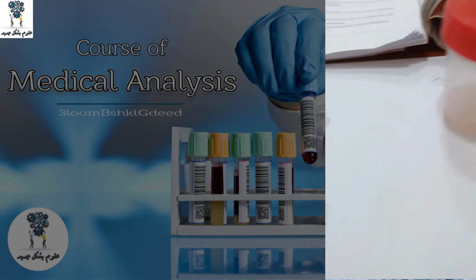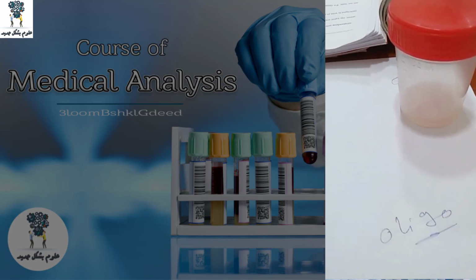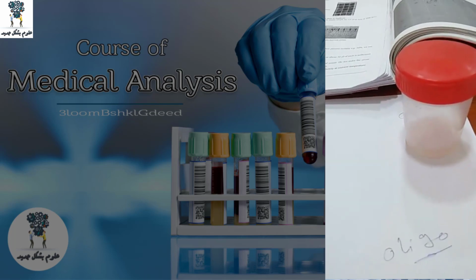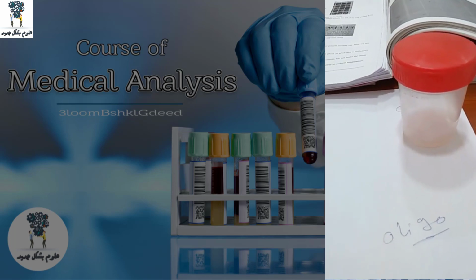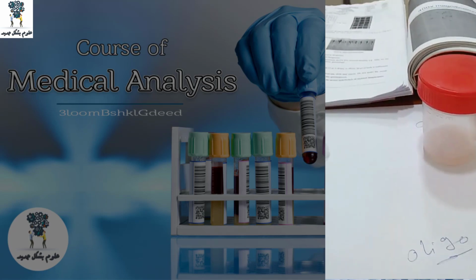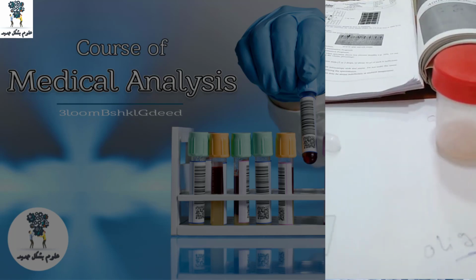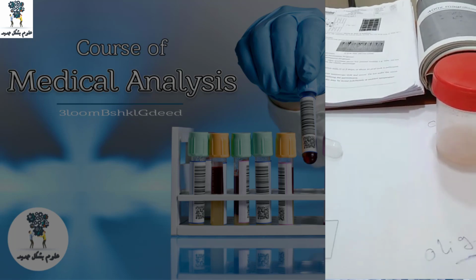The word oligo is used when we have a low number, and zoosperm is for the spermatozoa. This is a terminology used in the laboratory for this test.